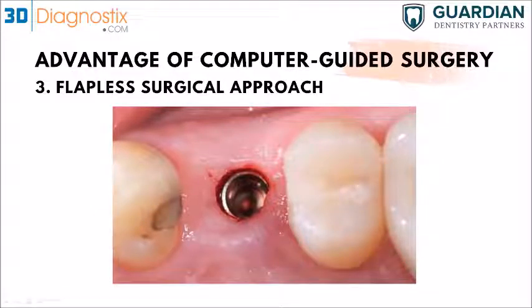I would love to get some input, but we have some great clinicians here participating, so their thoughts would be awesome to share. So Dr. Grimes is asking, 3DVX has usually provided guidance regarding whether it needs to be flapped. I've always used a punch. Only problem I have run into with flapless is the bony contour. So Dr. Grimes obviously has used your company before, and you guys usually make recommendations, right?